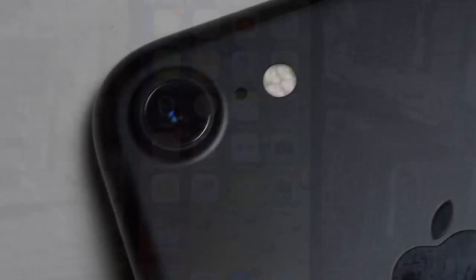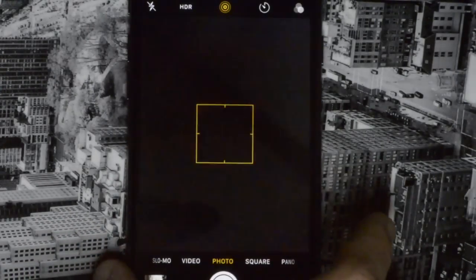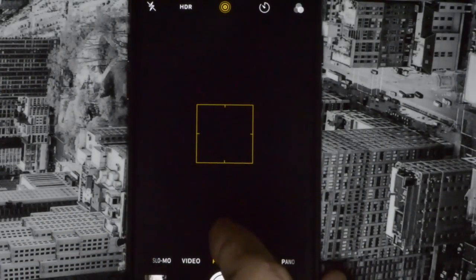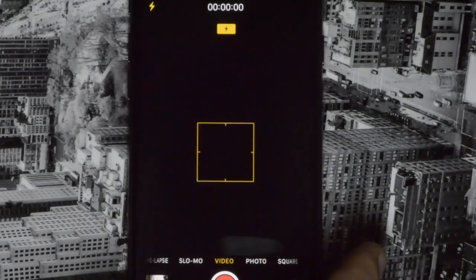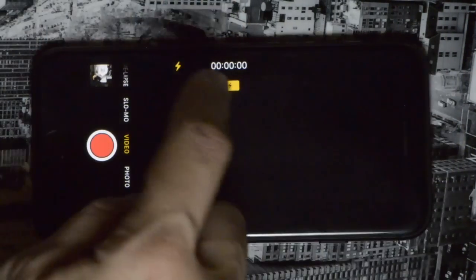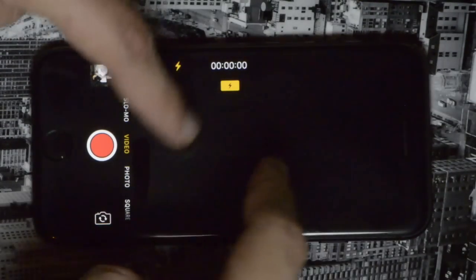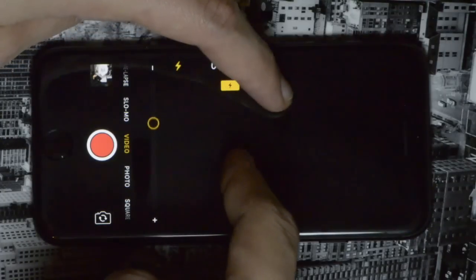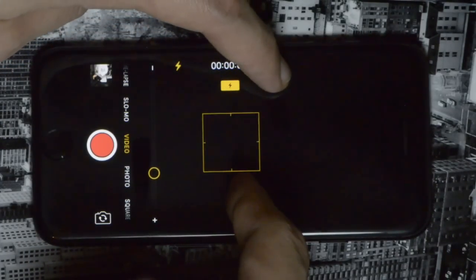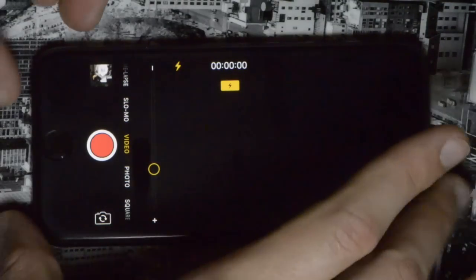the camera should work. First, open the camera app in your smartphone, then switch it to video mode. This way, the flash lights continuously. Be sure the flash is turned on. Now, zoom the camera by pinching out with two fingers up to 3/4 of the zoom bar. This way, I've acquired the best results.